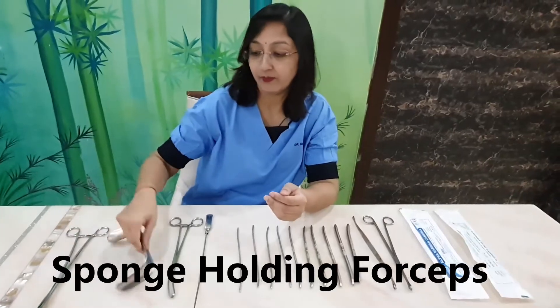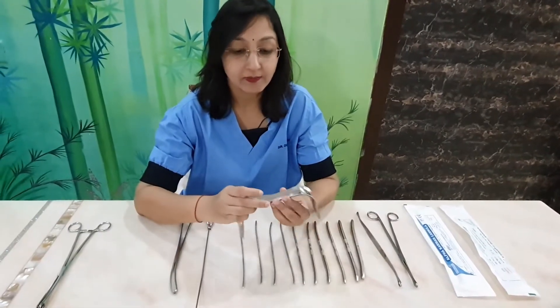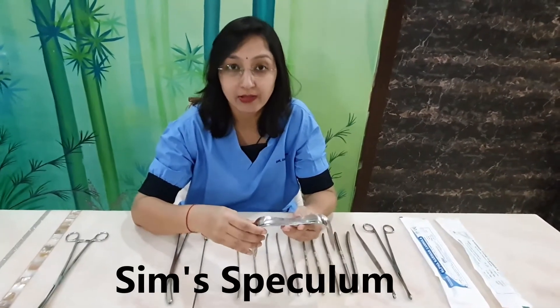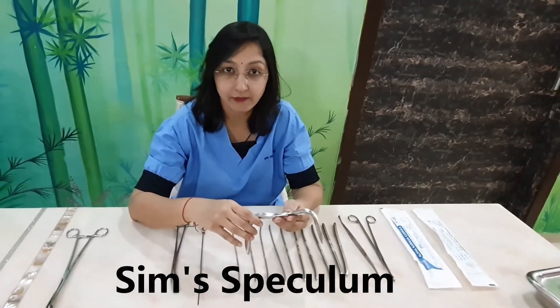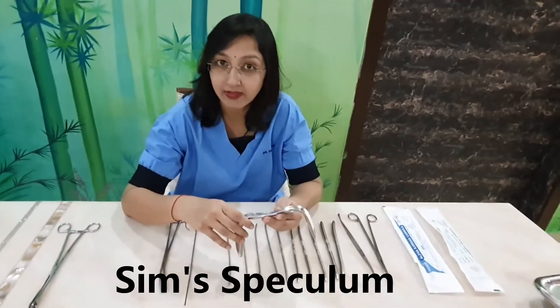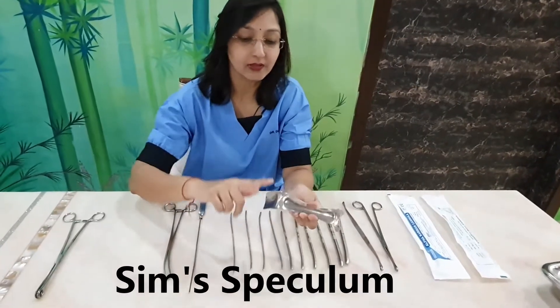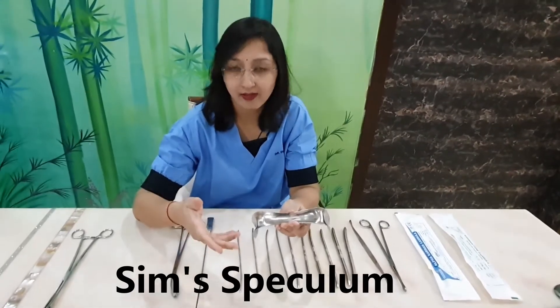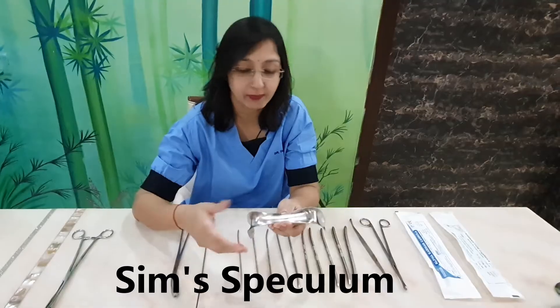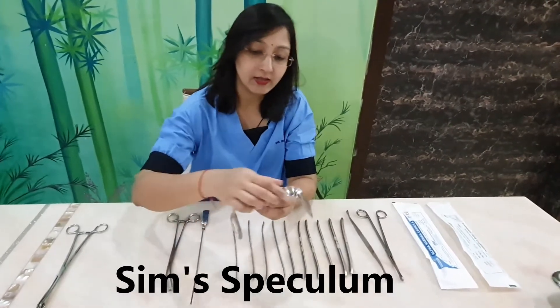After painting, we use this Sims speculum. Sims speculum is available in three sizes: small, medium, and large. Depending on the size of the vagina — whether the female is nulligravida or multigravida — we choose accordingly. It is a double-bladed speculum; single-bladed Sims speculum is also available, though the double-bladed one is more commonly used.